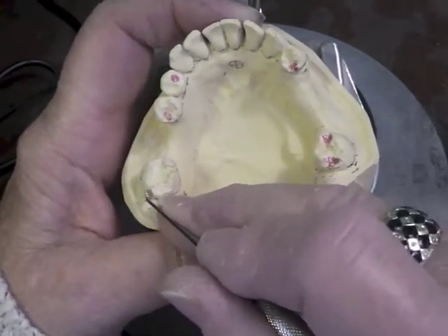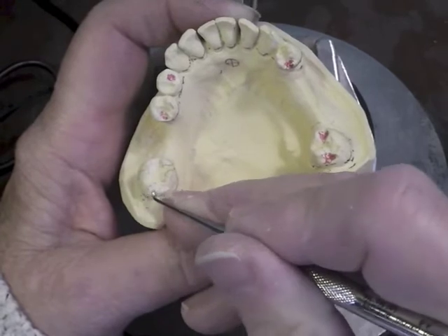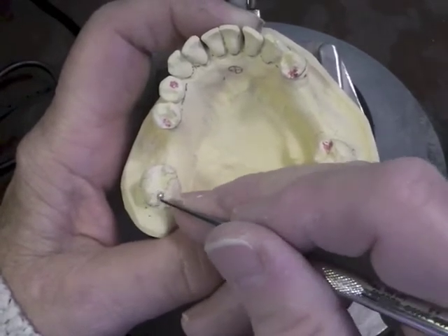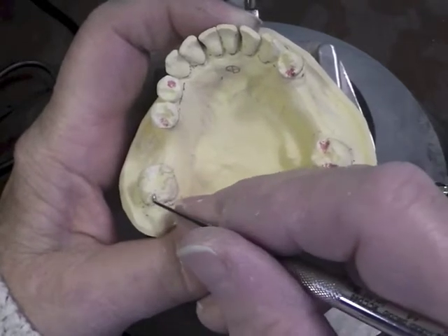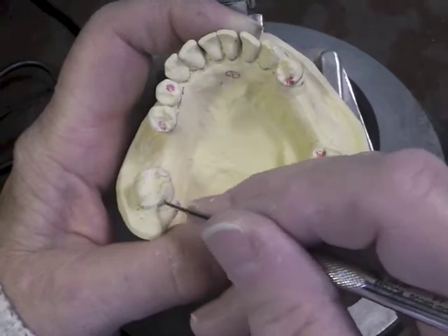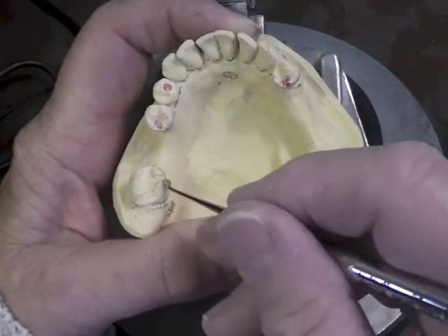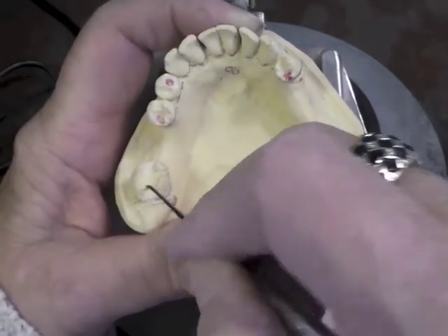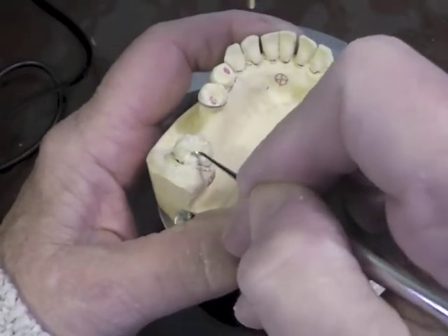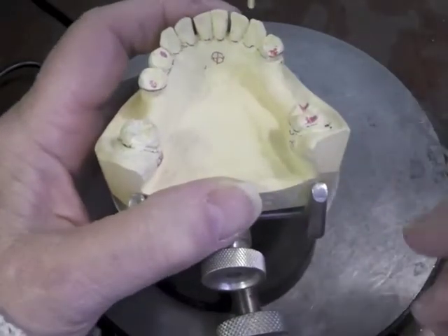I have an arm coming this way — my reciprocal component. So I want to have a little bit of a sluiceway here to recreate the anatomy of that tooth without making it bulge out. And then that arm is going to go in this direction, so I'm going to have a bit of a sluiceway through here. I have to make sure that this point is deeper than my marginal ridge, and I have achieved that.